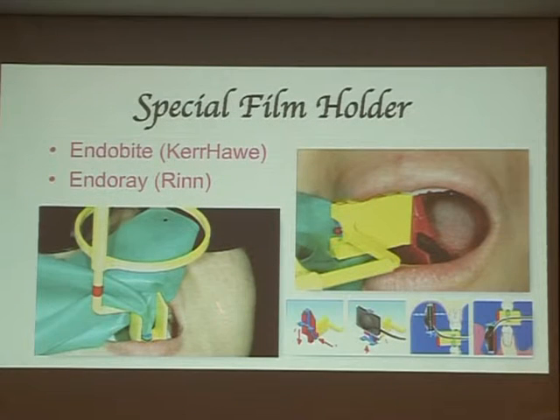Okay. So try to use some sort of film holders, and most of the film holders have been designed so that even when a rubber dam is used, you can still take an X-ray. There's no problem.